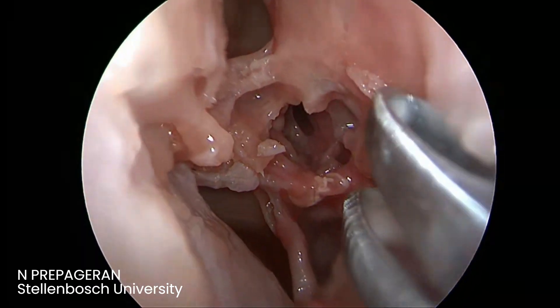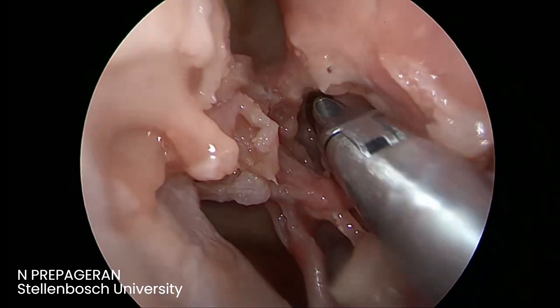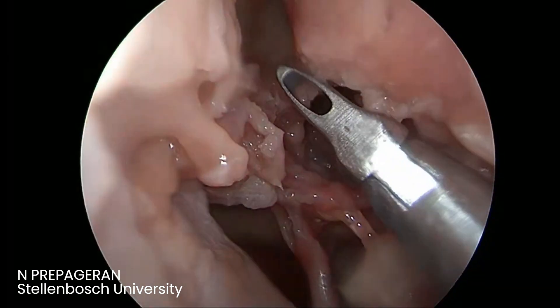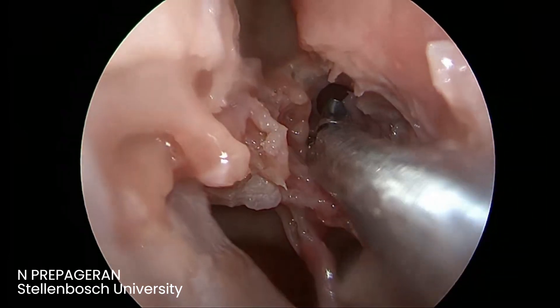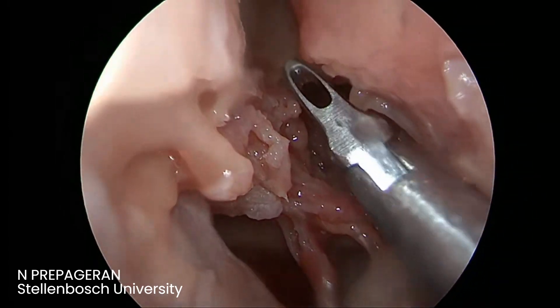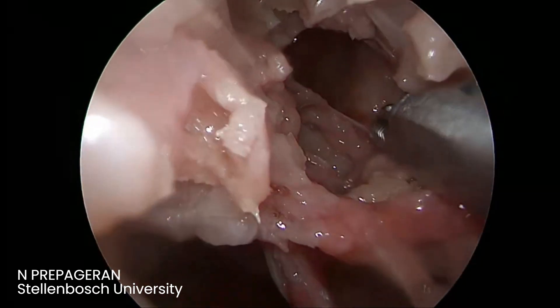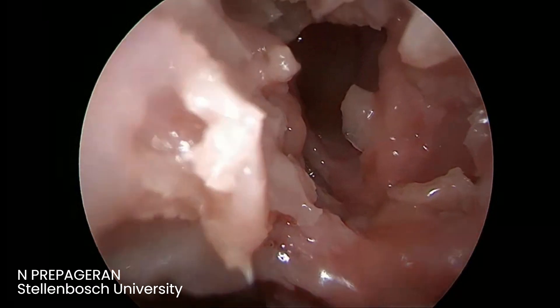So the anterior ethmoids will have multiple small ethmoidal air cells — about eleven. The posterior ethmoids will have much fewer. So now we are inside the pocket. We don't want to strip anything; we want to preserve the mucosa as much as possible. I'm using a curette. All the mucosa in the back — just look at it.